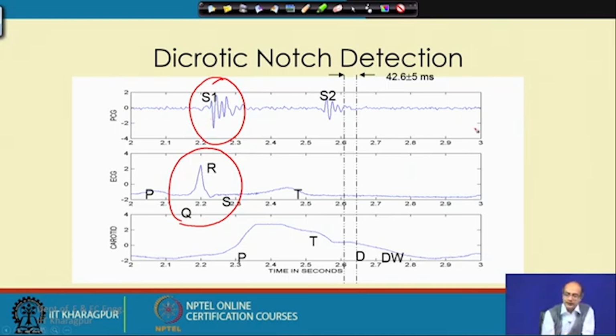The PCG signal shown here is a very clean rendering of it. Actually it is superimposed with lots of noise, including power frequency noise and high frequency noise. So, we do not get such a clean signal. We need to have some idea of where the S1 and S2 sounds are occurring. The first trigger to get the position of S1 comes from the QRS complex, and we have already seen how we can capture the QRS complex, the three algorithms we have learned.